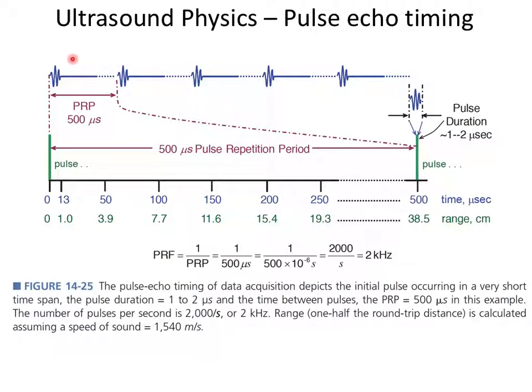So we're going to now look at the time base for just this one period here. Okay, and blow that up onto this axis. So we're going from 0 out to 500 microseconds, or half a millisecond. And ask, what is our depth range that the sound will go down, make an echo, and come back such that we can hear it? And here's the time that we're going, and this is the depth of the reflecting surface that we could achieve while we have that thing open.